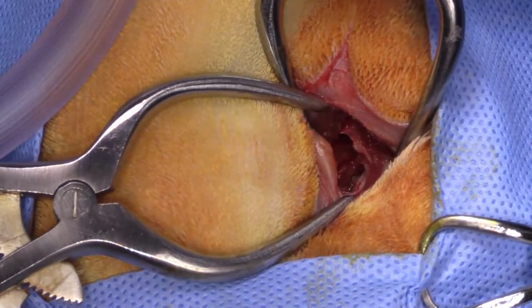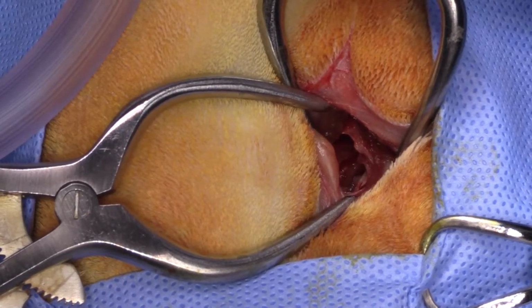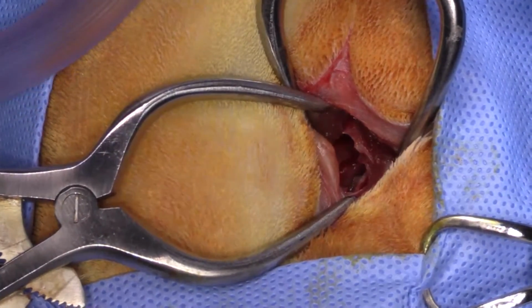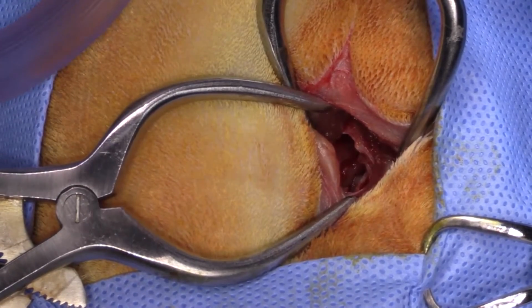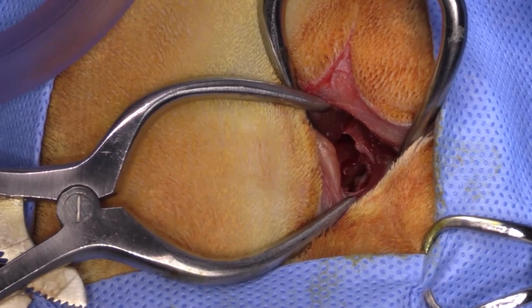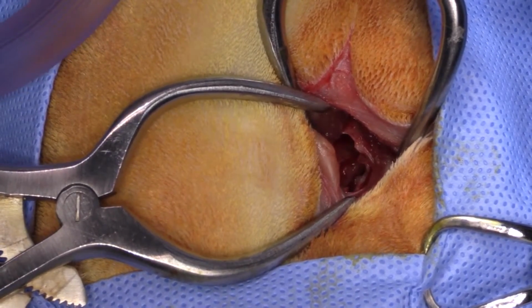Can we get some saline, please? Did I get that syringe? I thought I did, but I don't know where it's gone. Might have fallen off the table or something.